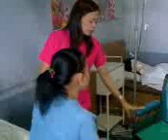So when we say, for example, the patient is left hemiplegic, sabihin, the left side is the one that is affected. So from bed to wheelchair muna namin. Okay. So always remember, if the left side of the body is being affected, you will always place the wheelchair or the chair or the commode on the non-affected side so that the patient can easily move from bed to the wheelchair.